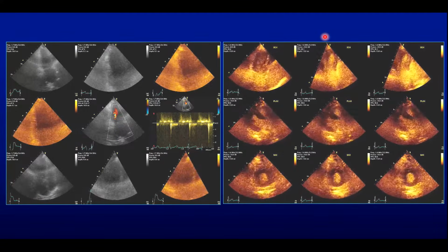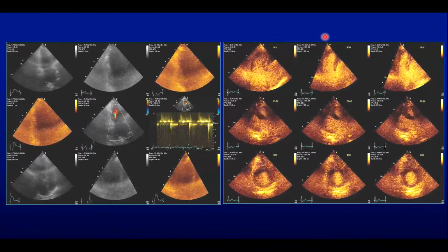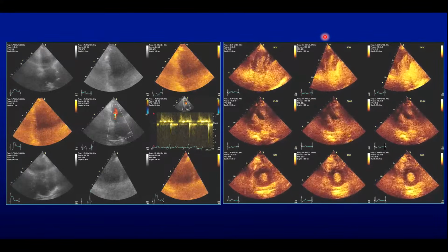Ventricular function is good. And nowadays, truly, if you are in a good laboratory, even an outpatient laboratory who is just a private practitioner in an outpatient laboratory, you should be able to do that. Nowadays, it is inappropriate to not interpret almost anything, particularly use contrast.